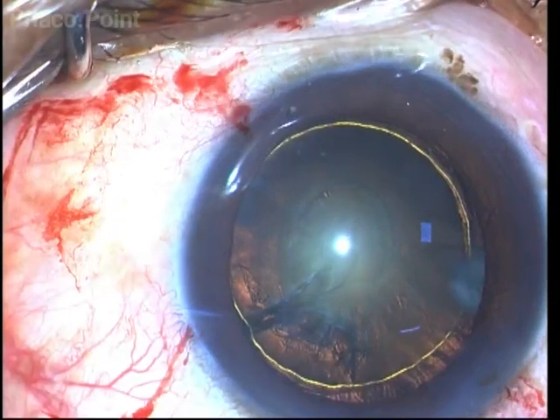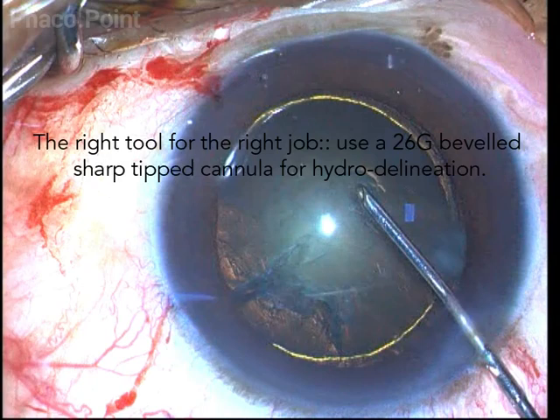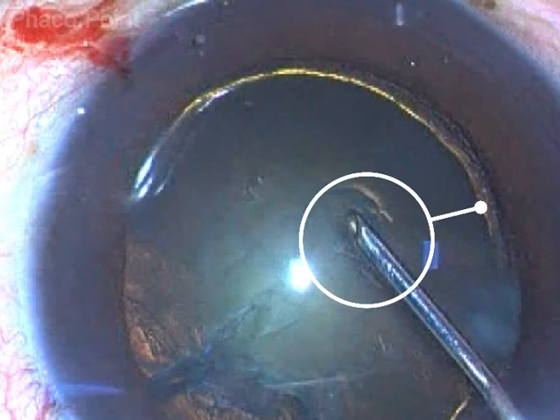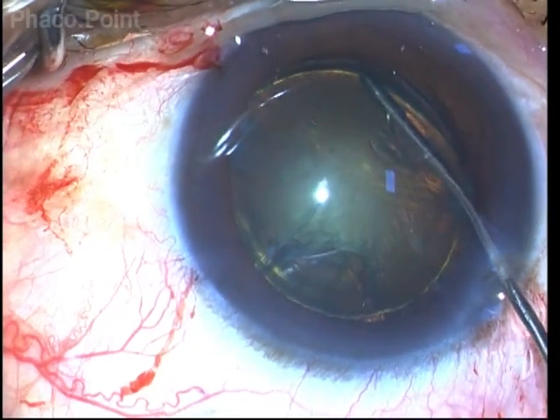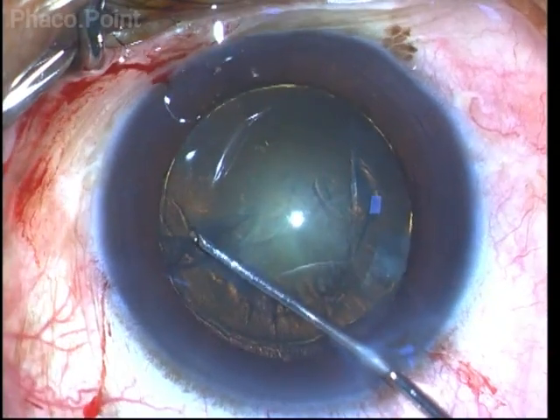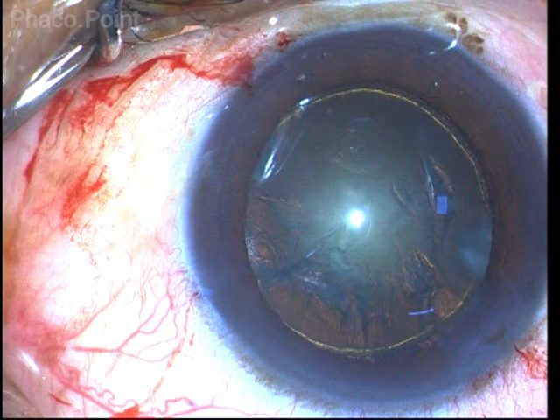For the purpose of performing the hydrodelineation, we need to choose the right type of cannula. We recommend using a sharp beveled cannula which can be insinuated through the epinucleus until it hitches against the hard nucleus core, after which a small aliquot of fluid can be injected to delineate the endonucleus very clearly. Please avoid using round cannulas or blunt tip cannulas, which will be difficult to push through the substance of the epinucleus.